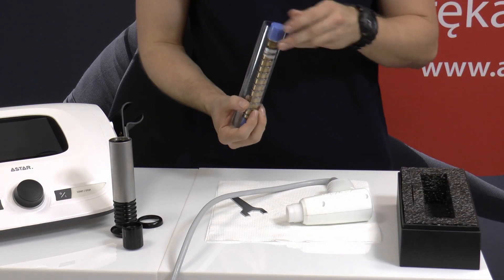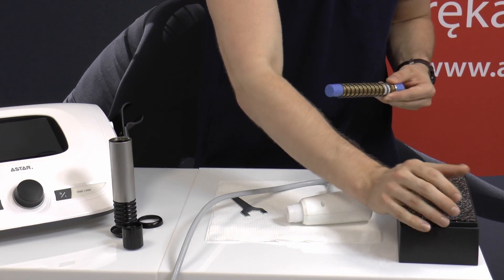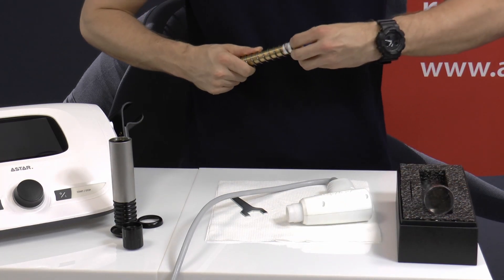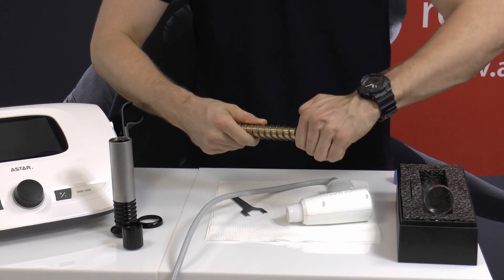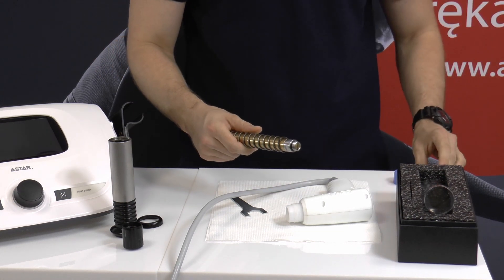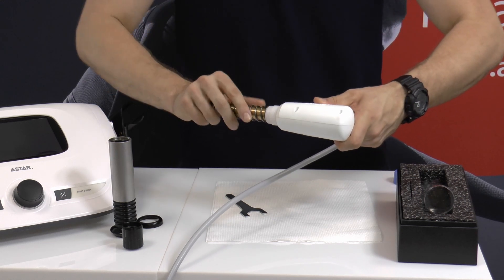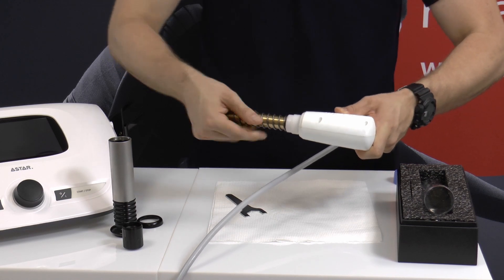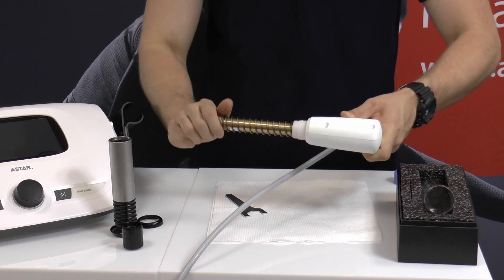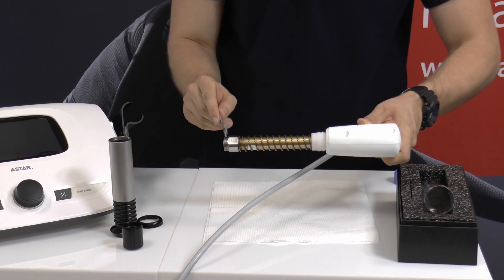Take the new projectile system with the spring out of the box. Remove the blue caps, insert it into the applicator socket, press down and hand tighten until it stops. Then tighten it lightly using the wrench attached to the kit.